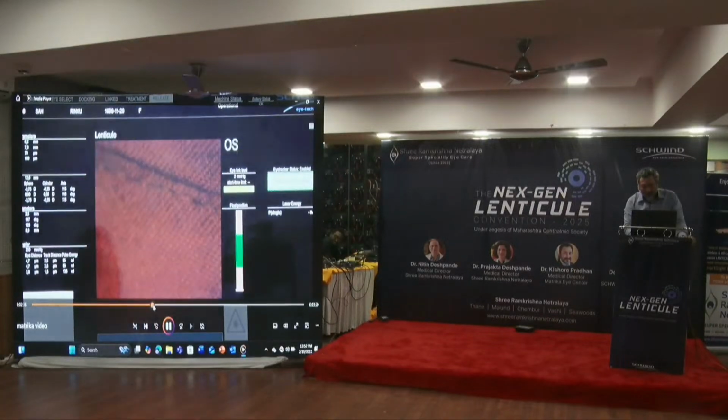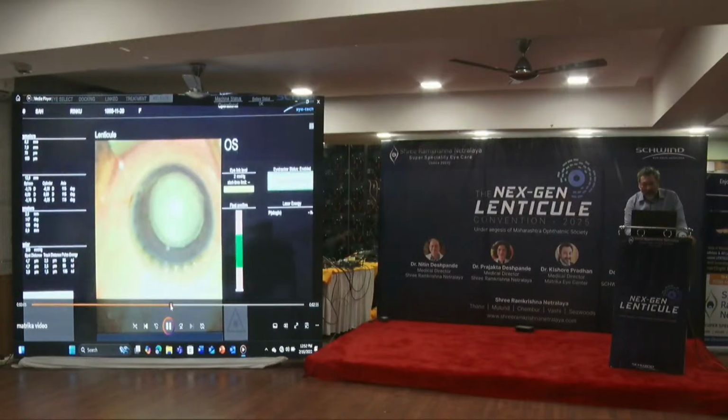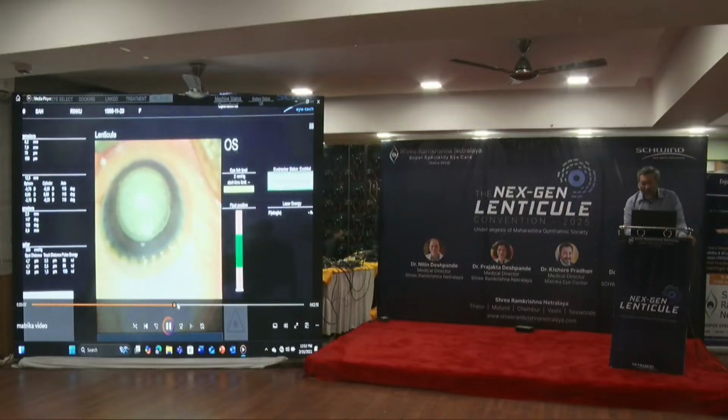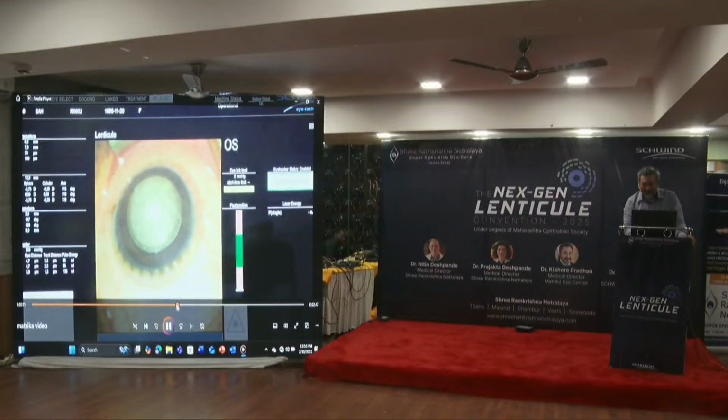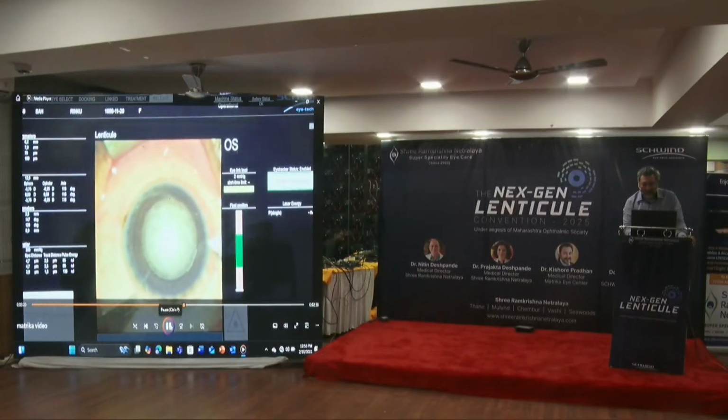So everything is down. Okay, let me show you the surgery. Then I realized one thing is Dr. Nitin and me, we are operating exactly the same way, like, you know. Oh, so now you'll feel a little pressure from my side and a little pushing and pulling. I'm going to clean up. Don't move too much, otherwise you get a scratch. Very good. Leave it loose.